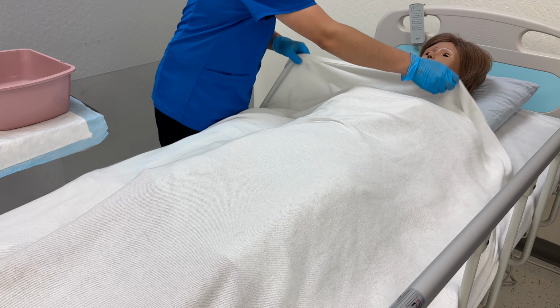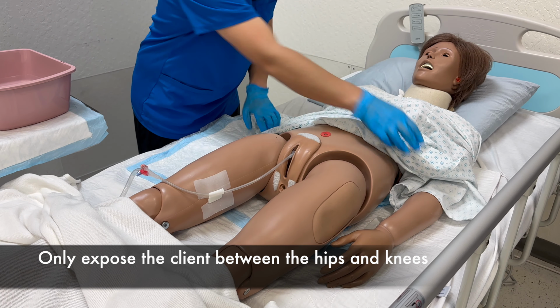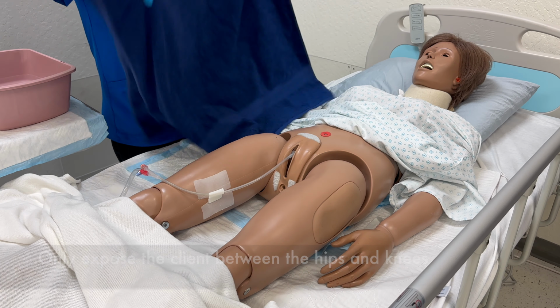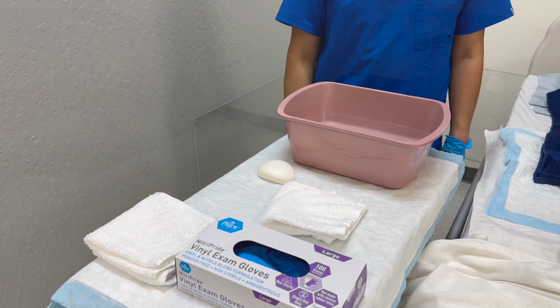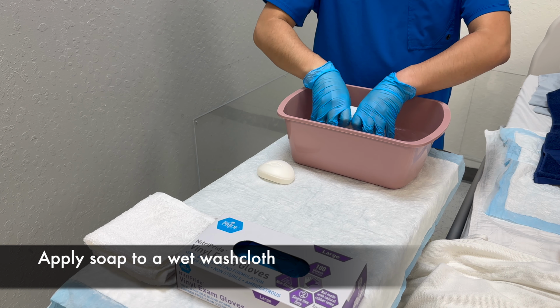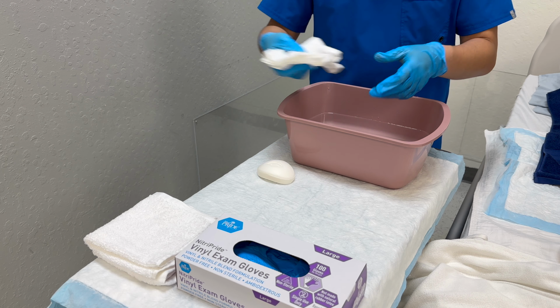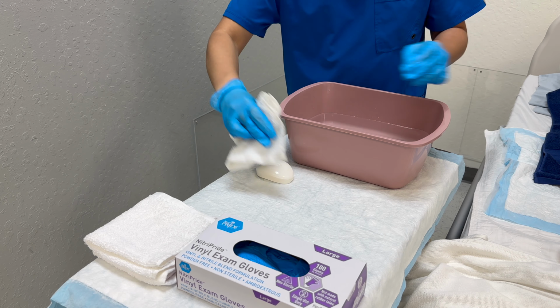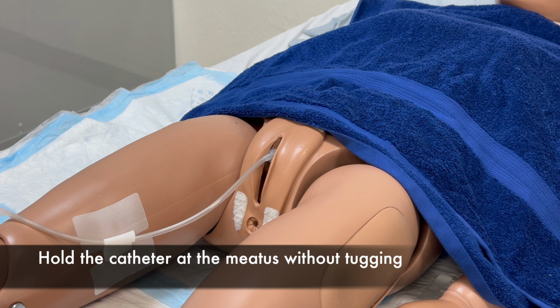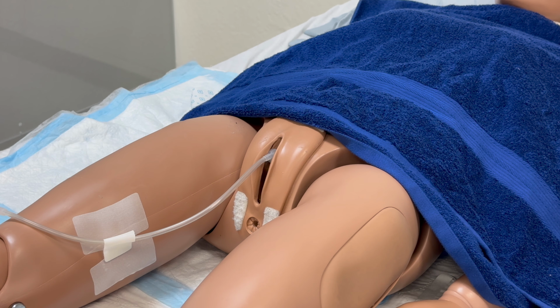Mrs. Smith, I'm going to lower the bath blanket. Apply soap to all the corners. While holding the catheter at the meatus without tugging, clean at least 4 inches of the catheter from the meatus, moving in only one direction from the meatus, using a clean area of the washcloth for each stroke.